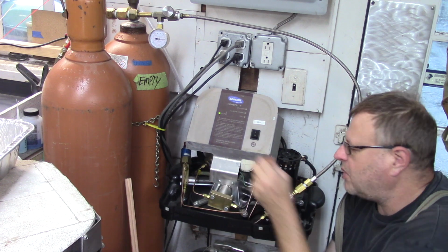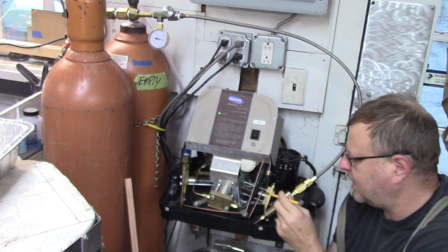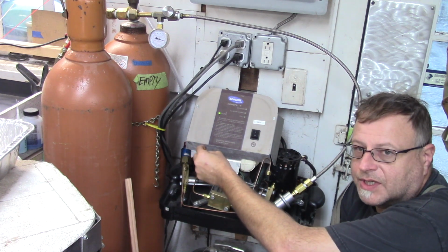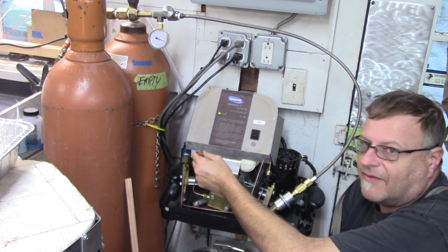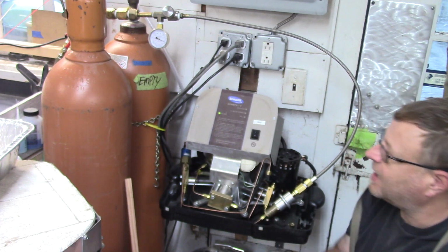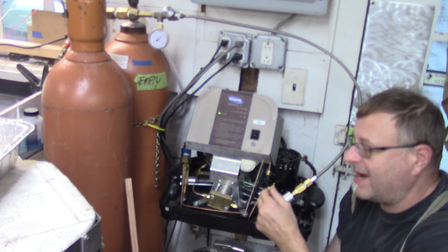If you blow the seals out like I did, and you don't bypass the system, you lose all of the pressure down to whatever the check valve is on cylinder number 3. The check valve on cylinder number 3 is about 500 PSI. The check valve on the outlet is 2,000 PSI. So this is a 2,000 PSI check valve. This is a 2,000 PSI check valve. That's a 500 PSI check valve. How do I know that? Because I ran the thing with the blown cylinders.